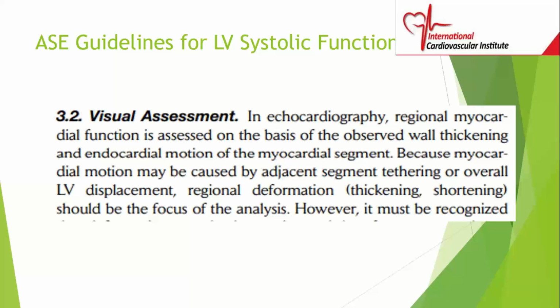The problem is motion, because you may have a segment or region which is infarcted or ischemic, and it's not thickening, but it has motion.